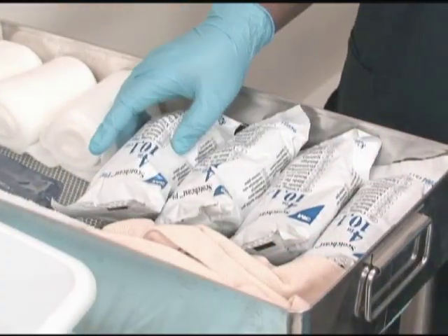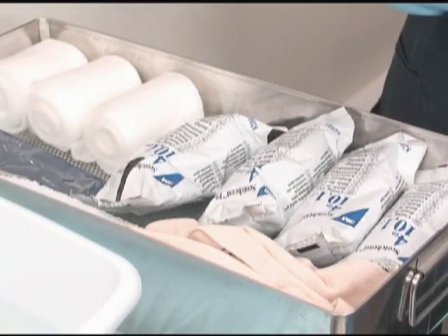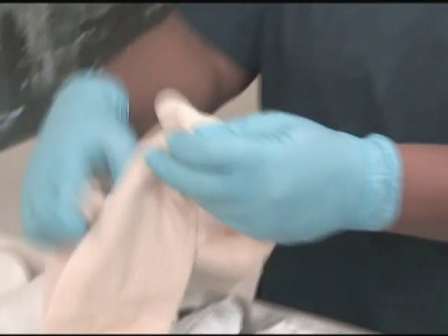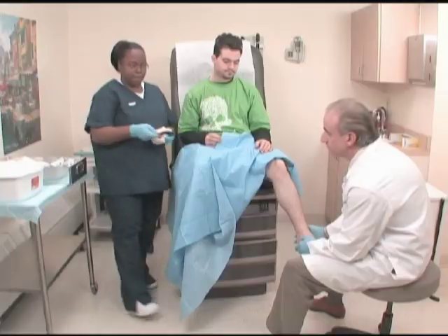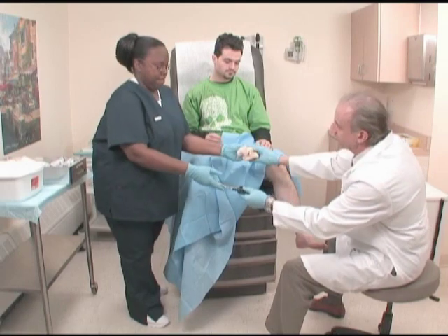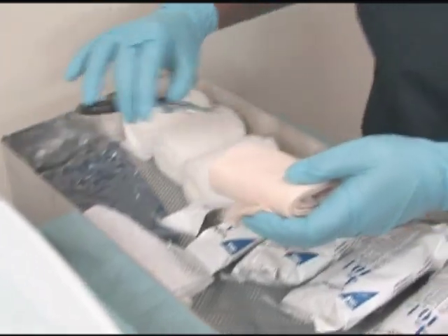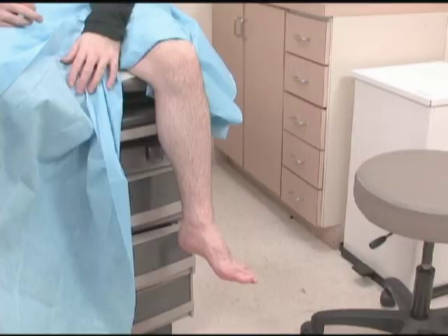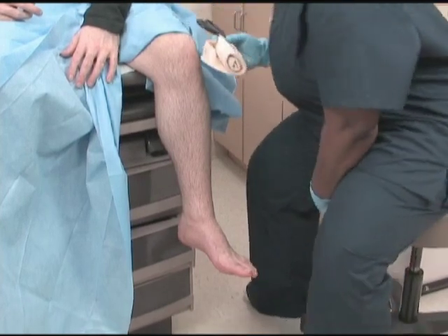When the physician arrives and is ready to begin casting, open one package of fiberglass material. To prevent waste, do not open the other packages until they are needed. Hand the physician the materials requested. If your medical office allows medical assistants to perform the preparation for casting, begin by cutting the stockinette to fit the area to be cast.